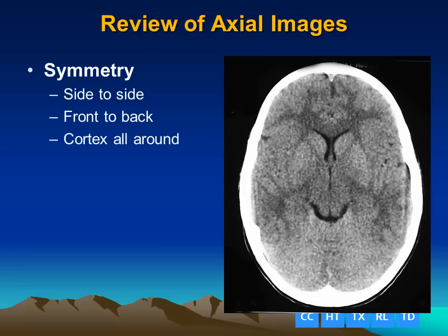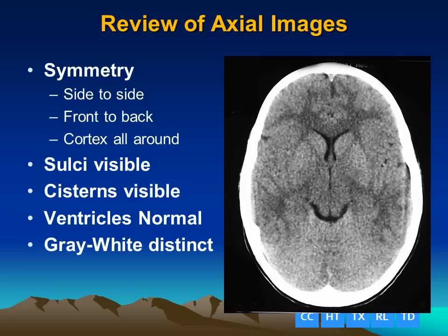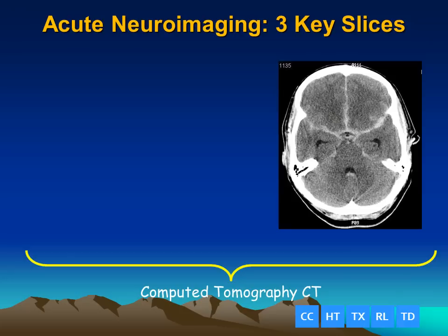If we review the axial images, we want to compare them from side to side and front to back, and look for the cortex all the way around. We want to make sure that the sulci are visible, the cisterns are visible, the ventricles are normal, and that we can see the gray-white matter distinction. We can also look at the skull and scalp for signs of trauma.